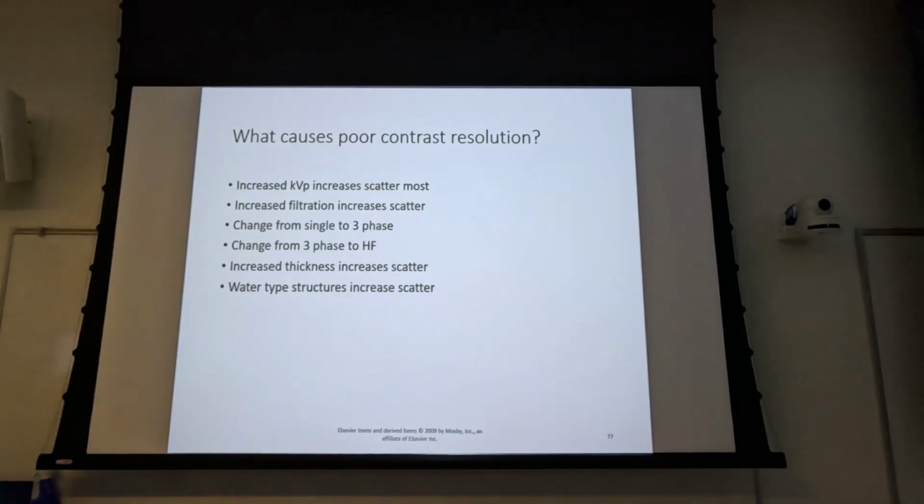It doesn't. So eventually I think we're going to make a change where we increase kVp another maybe 15%, cut the mAs in half again. And in that, we're going to cut the patient's dose down probably by, I don't know, maybe 20, 30, 40%, something like that.